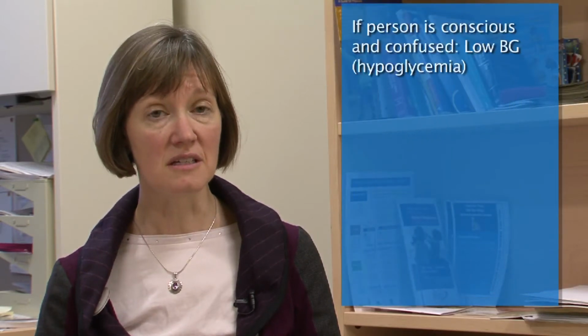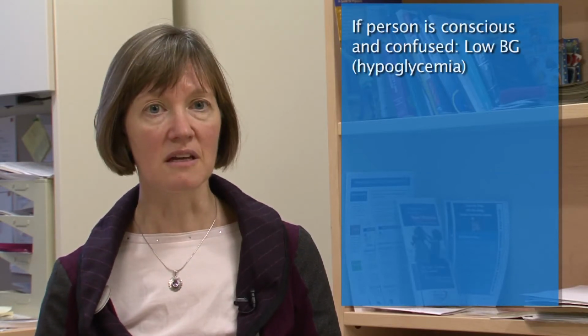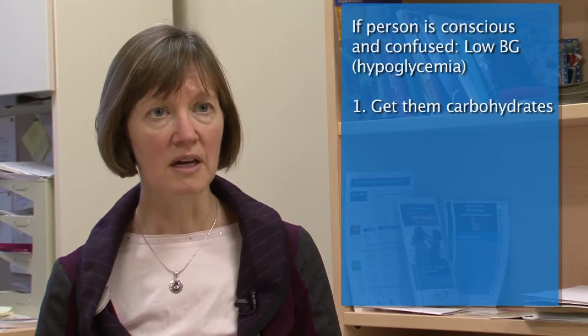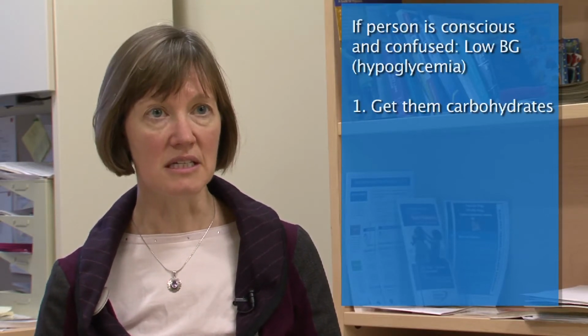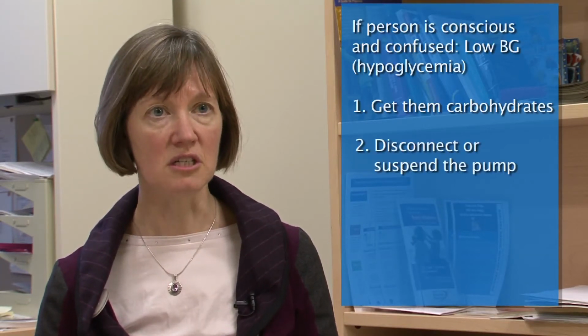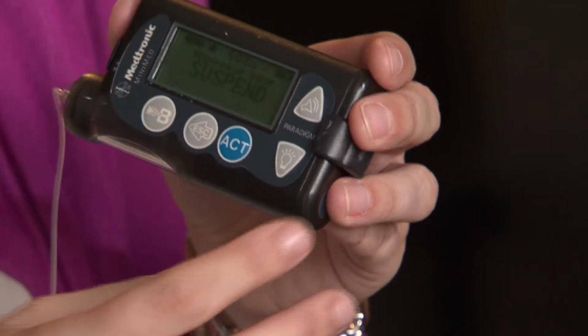If the person's conscious and has a low blood sugar or is confused, then they need help to treat their low blood sugar. So the first step is to get them something that contains carbohydrates to drink, like juice or regular pop, anything that has sugar in it. Then the next step would be to disconnect or suspend the pump. If the person can't do it for you because they're too confused, you can just disconnect the pump. In certain instances, if the person is hypoglycemic, suspending the pump is the ideal way to manage that. And then you would go on with your usual hypoglycemic protocol.